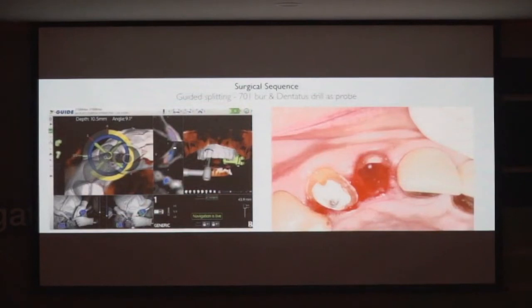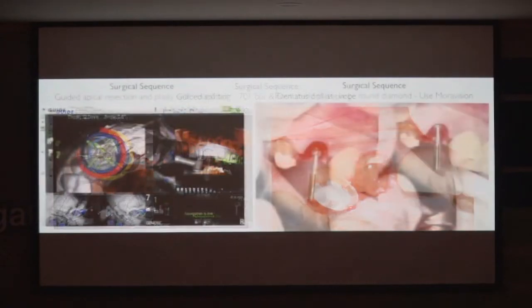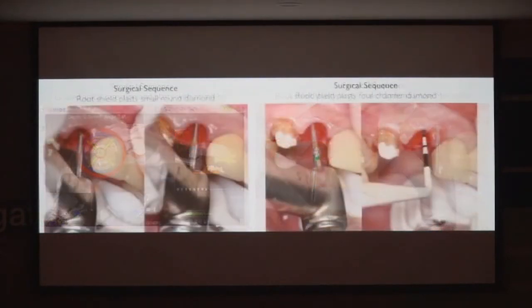Now you can see, if you look at this 2D view, I'm out laterally. You see there's not a lot of space, and I can make sure that I've obliterated the apex, but I haven't gone into the adjacent teeth. And this is what I'm left with. And then I'm going to plasty that down. I like to use the microscope to do it.